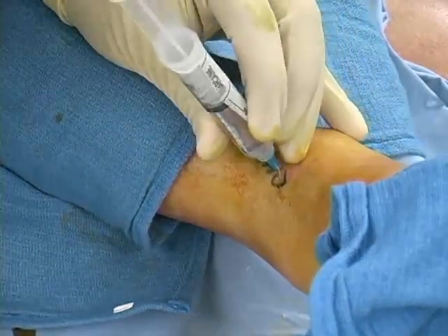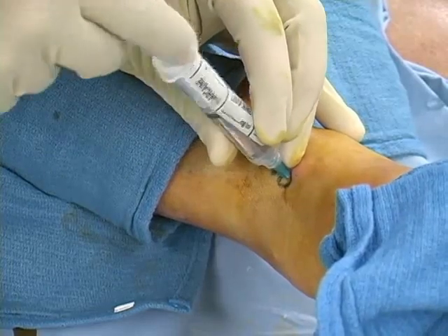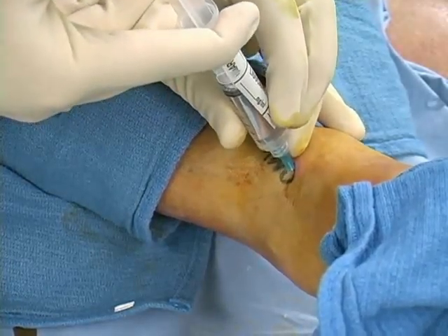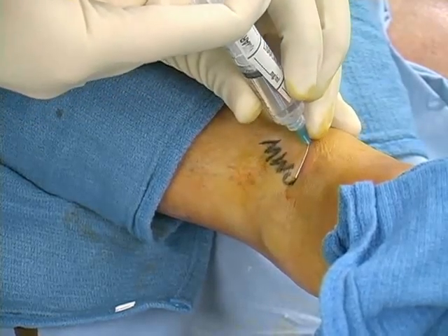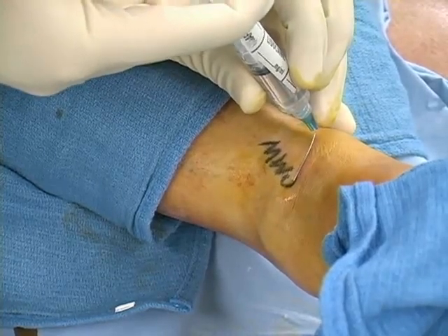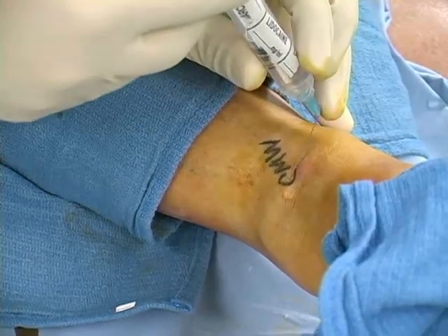When the needle tip nears the lateral malleolus, inject five milliliters of local anesthetic while simultaneously withdrawing the needle toward the anterior tibial ridge. The infiltration of anesthetic should cause a visible rise in the skin surface, indicating sufficient distribution of the anesthetic to all branches of the superficial peroneal nerve.